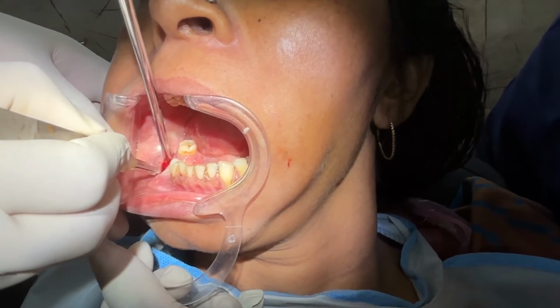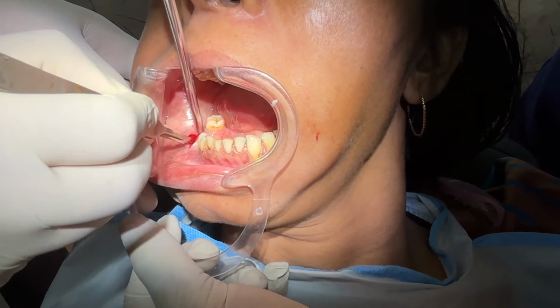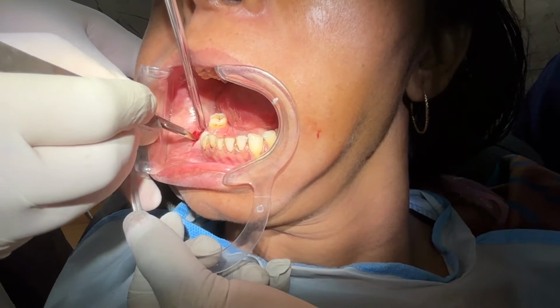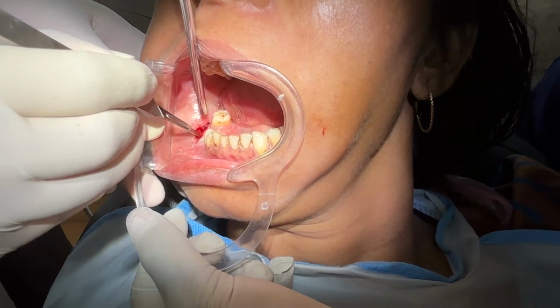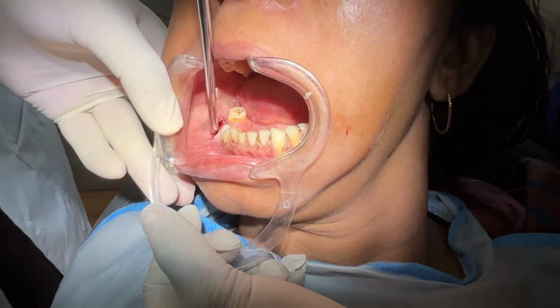Okay, I am deepening it to the bone, so I can see the bone here. I will not go anteriorly as a few mental branches are there.